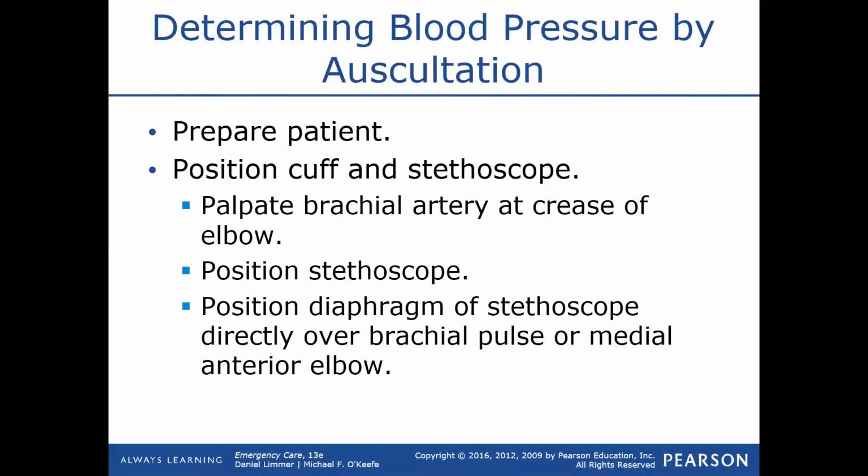So position the cuff and the stethoscope. Palpate the brachial artery at the crease of the elbow, okay? Position the diaphragm of the stethoscope directly over the brachial artery, or medial anterior elbow. Okay. Generally speaking, we don't palpate the brachial artery when we do a blood pressure.